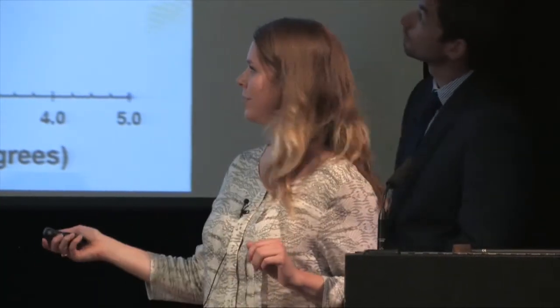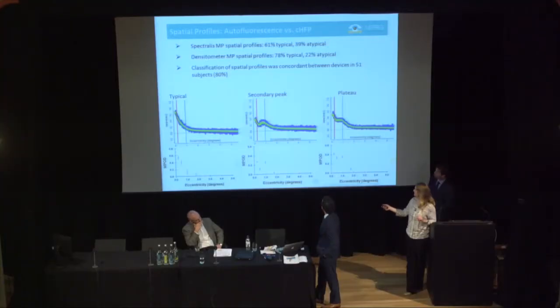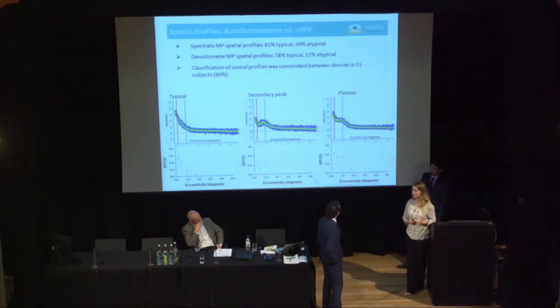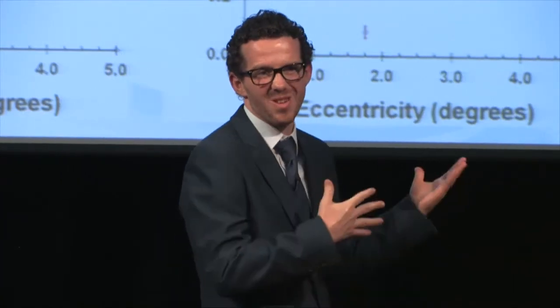So it was done by visual assessment, but as I showed here, for most of the people in the study it's quite obvious. They're either like this, or like this, or like this. This was originally termed the ring-like structure, if you remember the paper on this. It was a bit of a visual exercise. To answer the first part of your question, it did match our previous publications. The significance of it, again, is a conversation that needs to continue in terms of what this actually means.